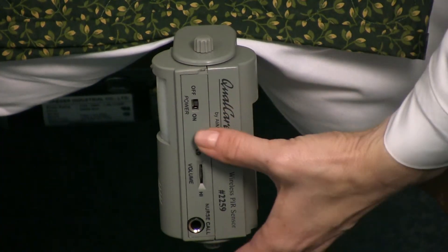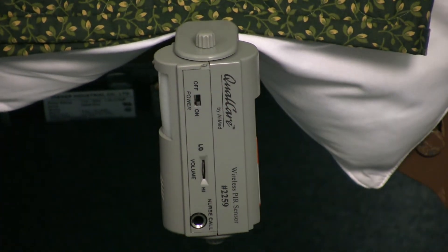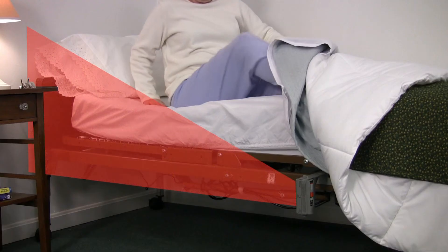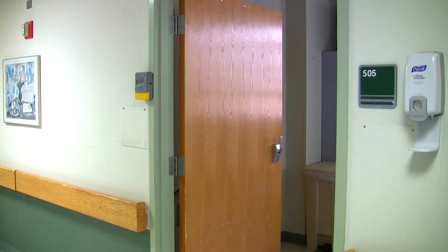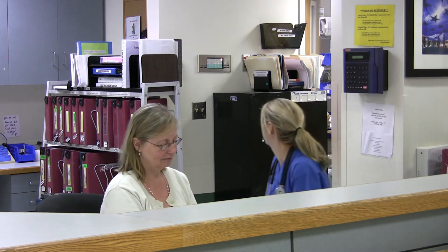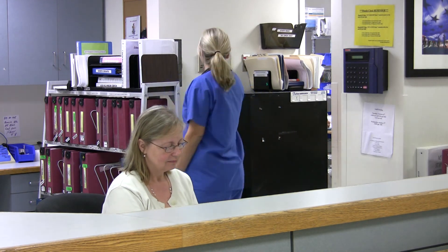With the unit mounted in the specified area and the patient in place, turn the device on. Remember, you have either 10 or 20 seconds before the alarm activates in case you need to cross the sensing field. When your patient rises and breaks the beam's path, the alarm will sound immediately at bedside, at the remote receiver unit, and at the nurse's station. Whether nearby, around the corner, or at the nurse's station, the caregiver now has even more time to respond to the patient who is now in danger of falling.